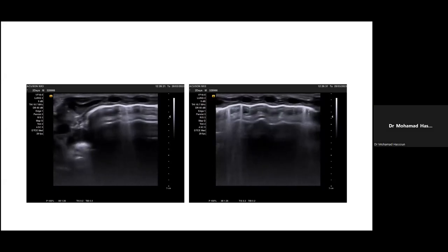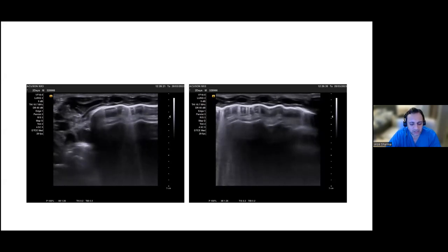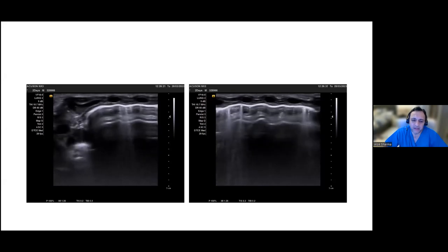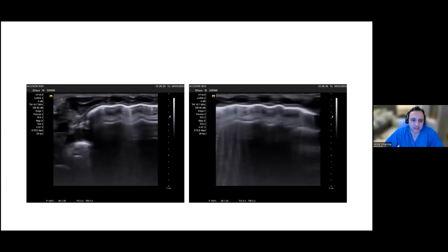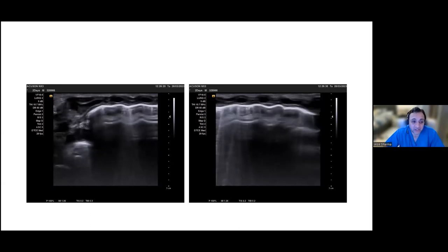And what I'd say is that the best way to evaluate these babies is serially. So really what you need is an ultrasound soon after birth. If at that particular stage you don't have any subpleural consolidations, you have a white lung interstitial appearance, which then changes into an appearance with double lung points and the absence of consolidations, that would go more in favor of TTN. But once you have subpleural consolidations, that is pointing towards an element of hyaline membrane disease or RDS. And it may well be that you have an element of surfactant deficiency, which is giving you that clinical picture.